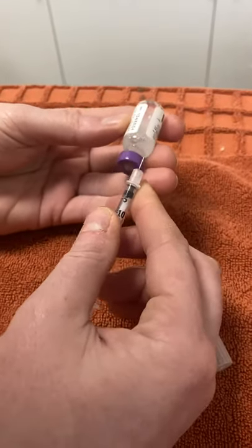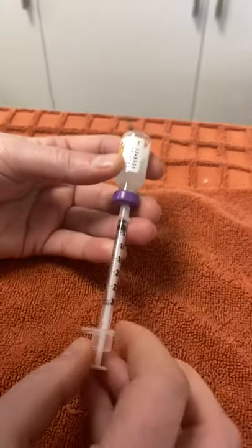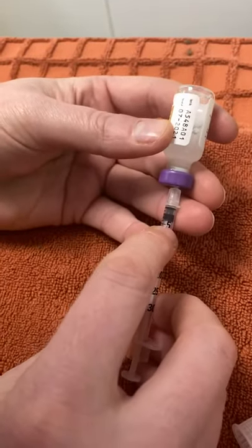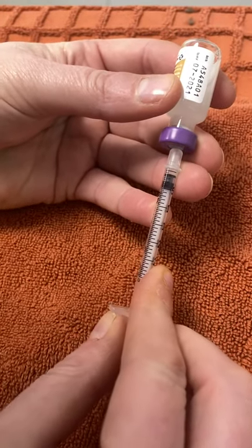We want to invert the tube and insert the needle into the bung at the bottom. I'm drawing up 0.01 mil. This marking here is 0.05, and 0.01 is this mark here.